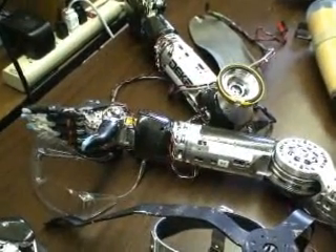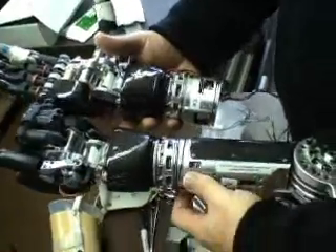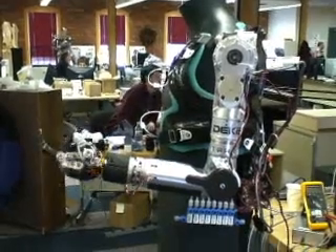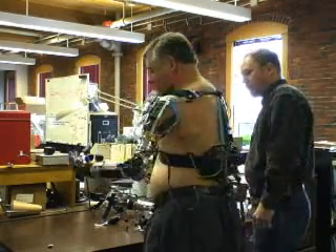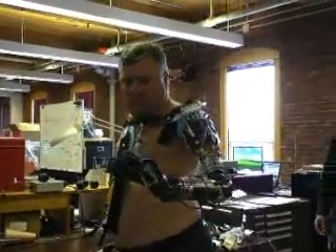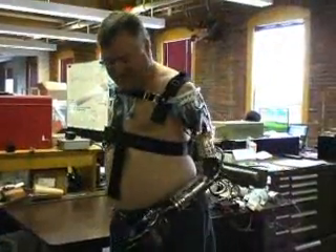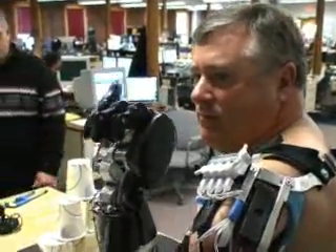DECA engineers built the arm in independent sections so it could be customized for any amputee — from the hand, they can add a forearm, an elbow, and even a shoulder socket. Hildreth lost both of his arms when he was electrocuted 26 years ago. Today he's testing a Luke arm on his left side, where he still has a short residuum. When asked what it feels like wearing it, he said: 'It's kind of liberating. I've been without an arm for 26 years.'